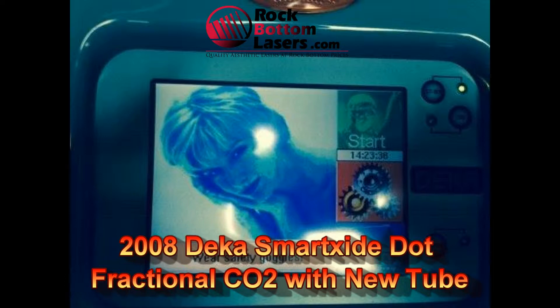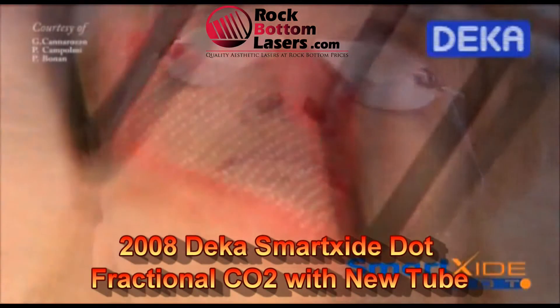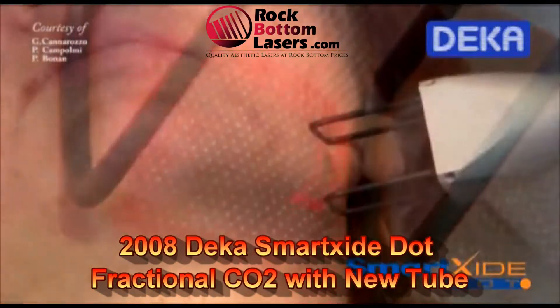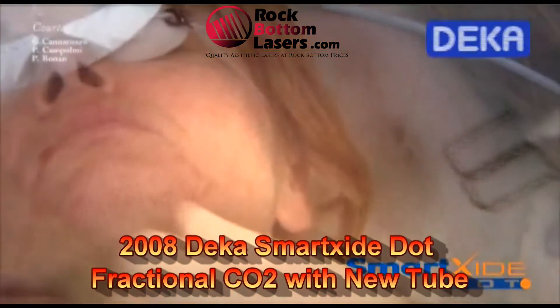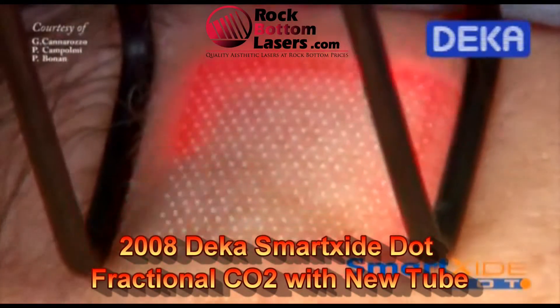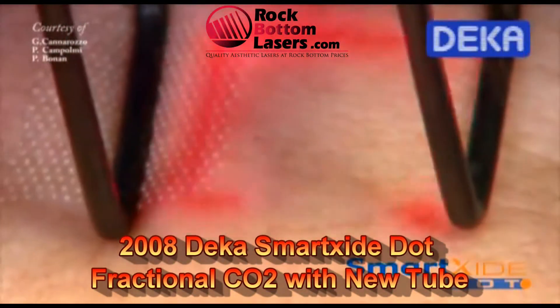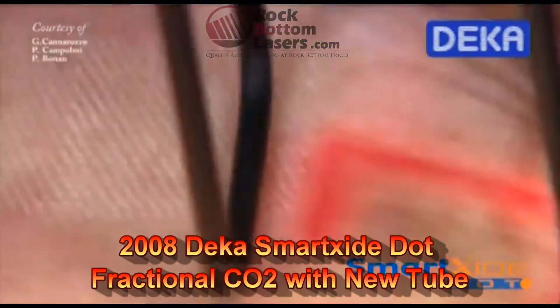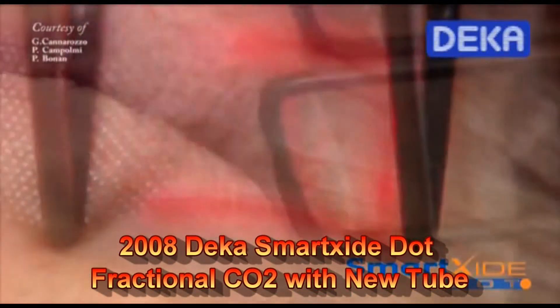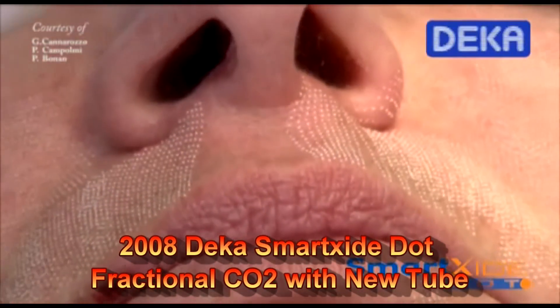This unit was manufactured in March of 2008 and one thing you want to look at whenever you're looking at buying a CO2 laser is how fresh is the tube — when has the tube been replaced. You always want to make sure you check the service records. In this particular case, the advantage you have is knowing that this unit has just had a brand new CO2 tube installed prior to shipment.